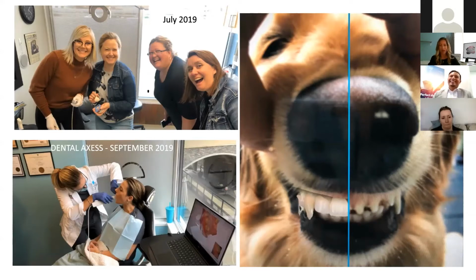This was just taken from my iPhone, and you're able to send it to the computer, and you can do smile design off your phone. You don't even have to have somebody in the office, which is another great point. So you've probably seen that post somewhere.